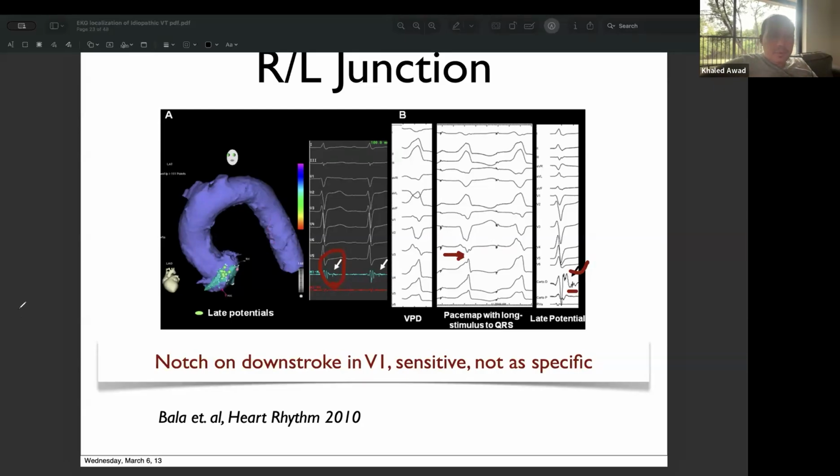And that's really important. Sometimes you're not going to get the activation and the pace mapping and all these classic things, and again, we talked about this last time, mapping systems are designed to think like an engineer. Okay. They don't think like a doctor.